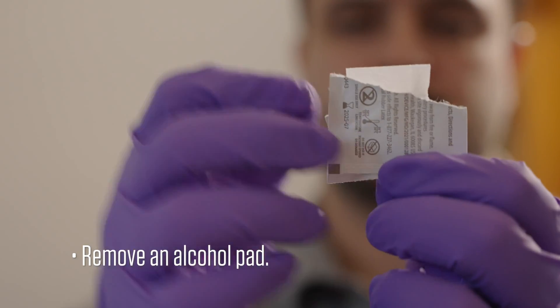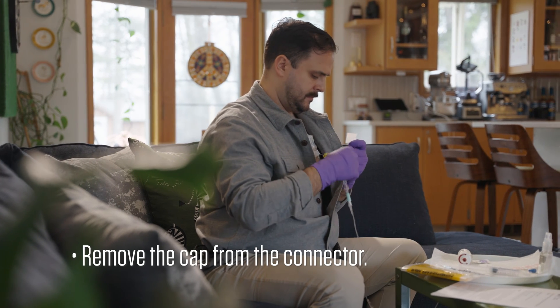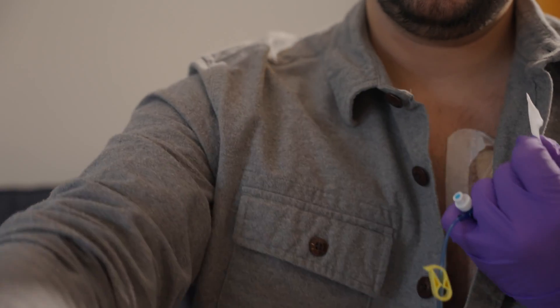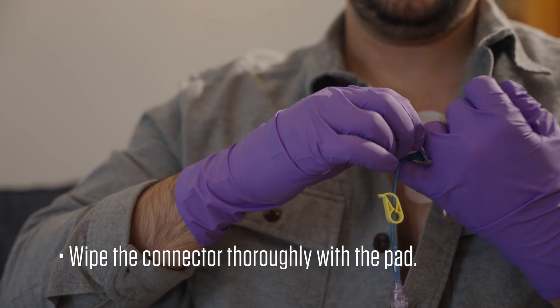Remove an alcohol pad. Remove the cap from the connector. Wipe the connector thoroughly with the pad.